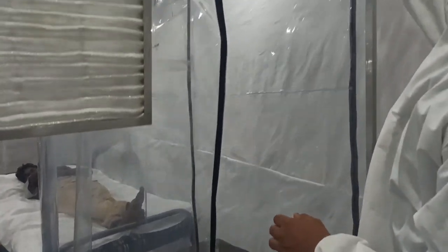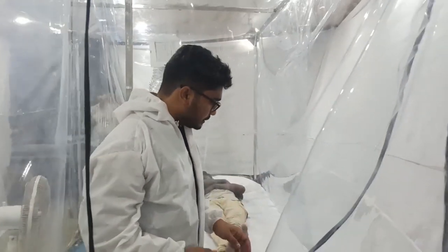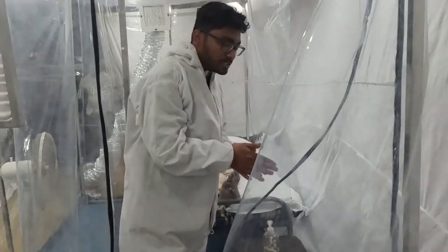The opening is through a zip or velcro based flexible door which gets you inside the anti-room, which is separated from the main room, and here you can sanitize yourself before getting inside.